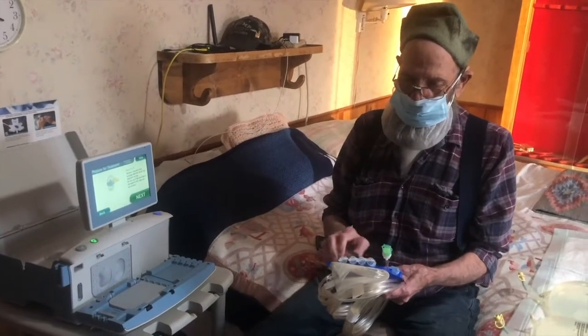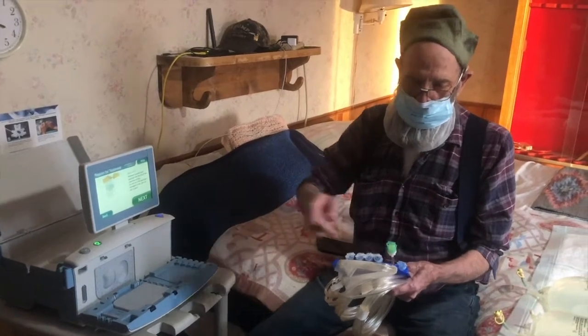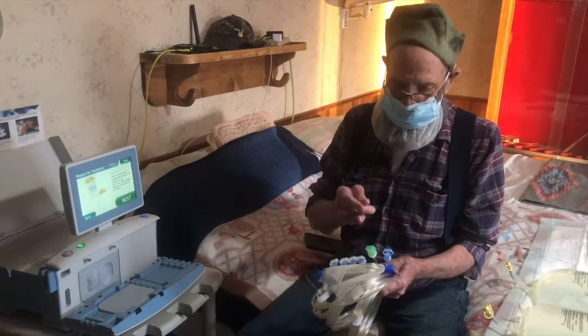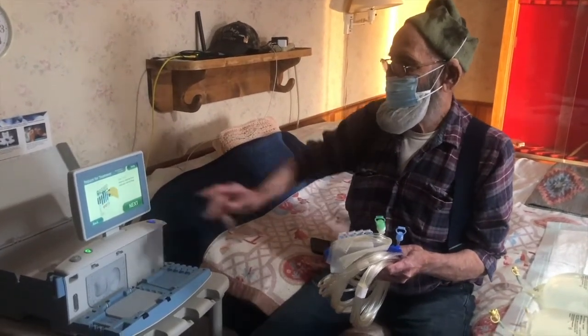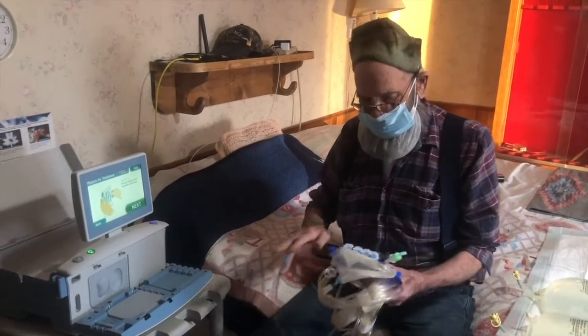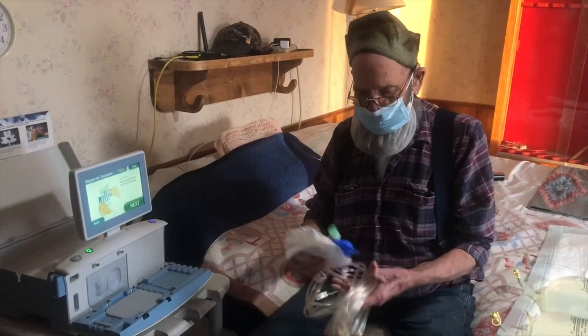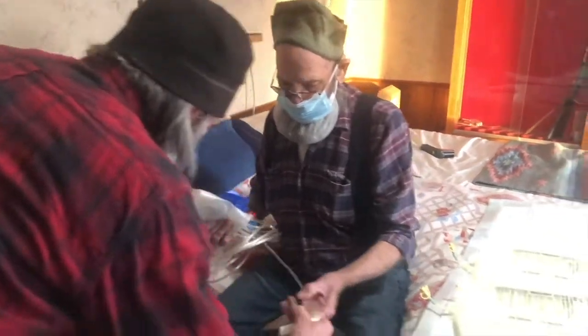And these other ones are the ones that bring the fluid from the bags to the machine and then put it into that line and bring it to me through this one. And then this one here is the drain. It says to remove the drain line from the line organizer and let it hang. That thing right there.